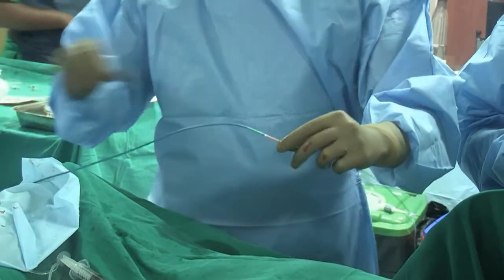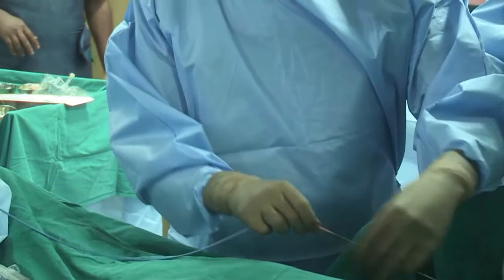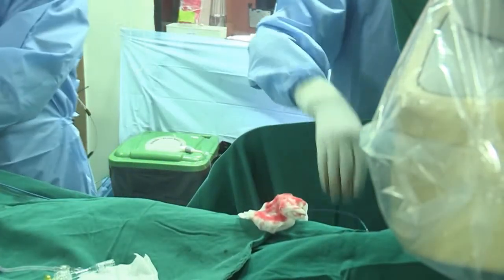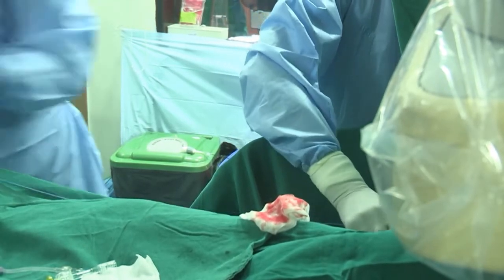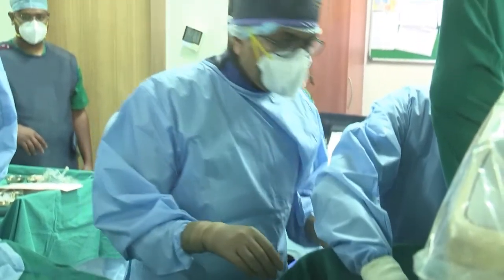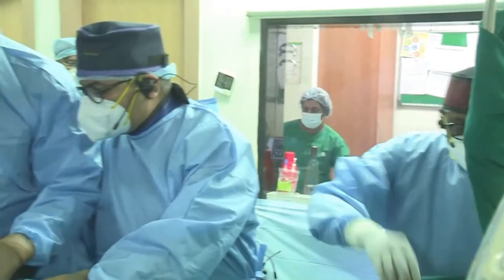Push this thing. It has to be in the front. Yeah, and just hold the wire. Don't pin the catheter. So this is how we have gone. Just 1 minute. Okay. So I think radial, if we are able to see, we are now entering. So let us go ahead.